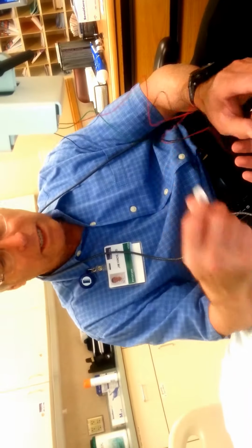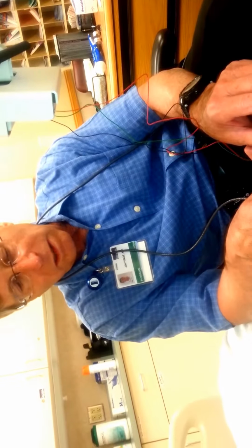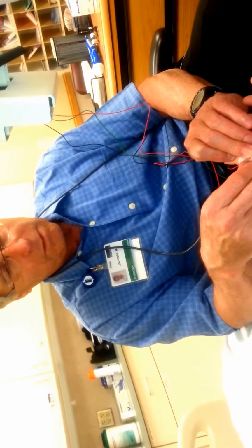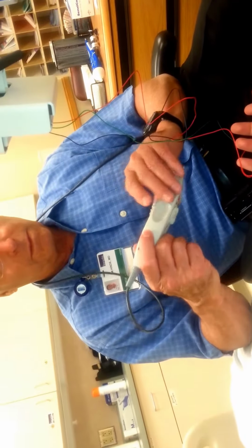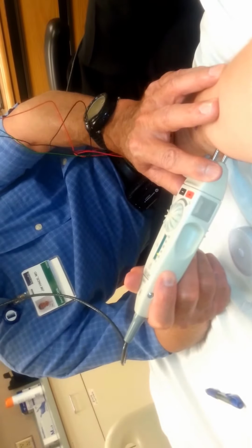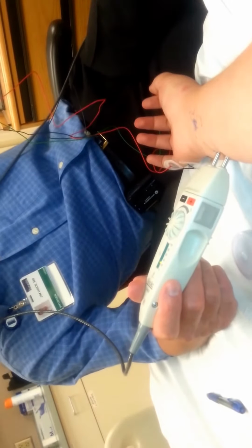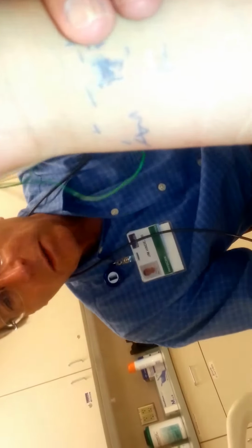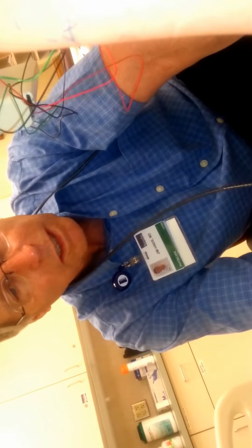Now let's compare that to the ulnar nerve, the nerve that goes to this side of the hand. So we'll see what we get across the wrist. Very fast, the same time exactly, 2.8 milliseconds. Okay, and that's super fast. Let's have you bend your elbow. Now we'll get you up near the funny bone. This is what you bump when you whack your elbow. You hit the ulnar nerve.